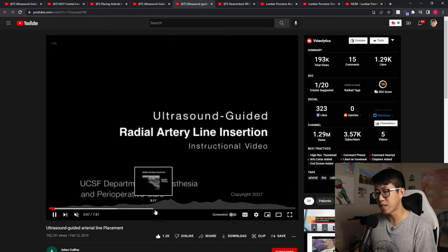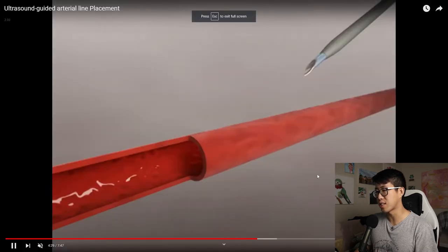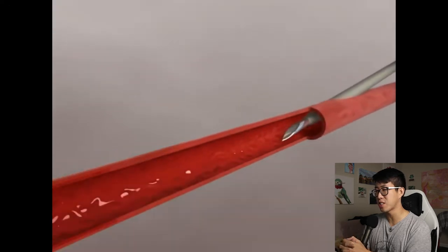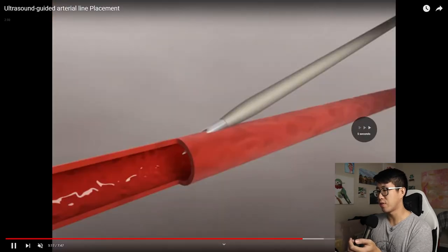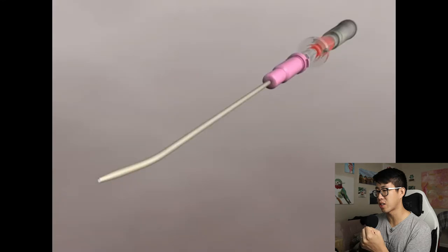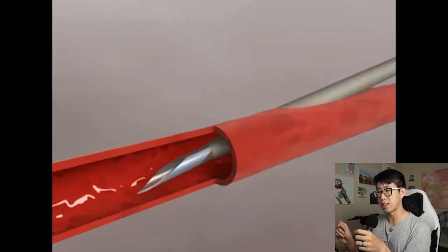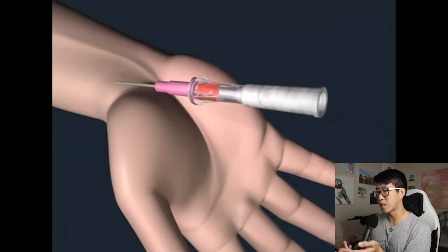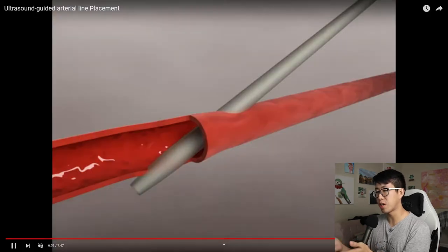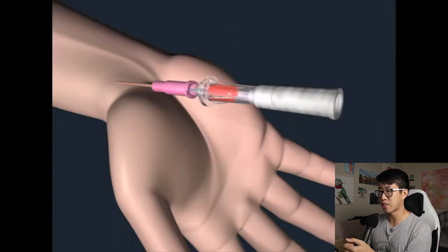Another video on ultrasound guided arterial line placement is by Adam Collins, and I like this one because it has a great troubleshooting section. It shows what it should normally look like when you thread the catheter and get good blood return. For example, if you immediately got flash and tried to thread the catheter, you'd just push the artery away - you need to go slightly deeper to get into the correct position. It also shows what happens if you backwall the artery - if you went too far, blood return stops, you retract the whole apparatus, get blood return back, and then advance the catheter. Another great troubleshooting video.